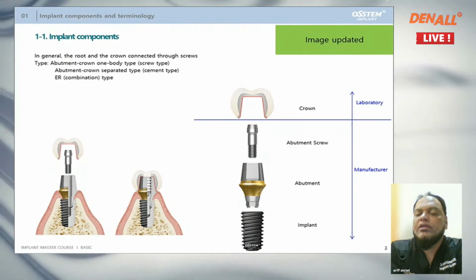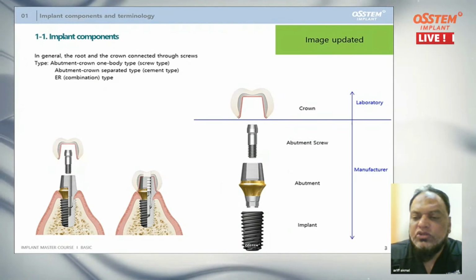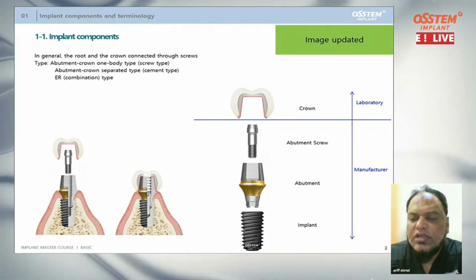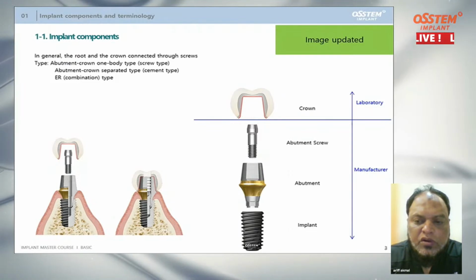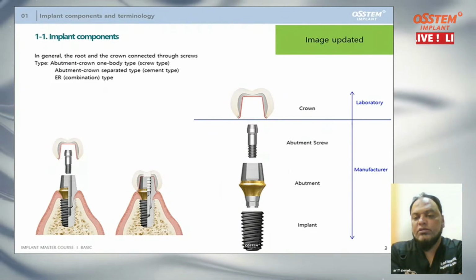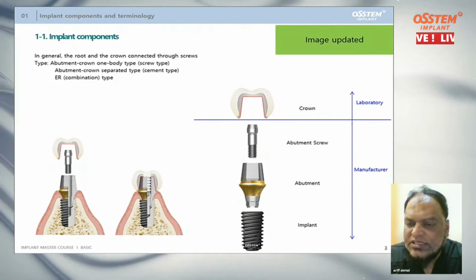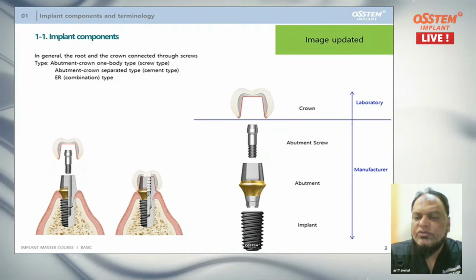So you should be able to manage. Luckily, the osteotomy was almost done. So I started placing the implant with an endomotor. That is how you should be able to manage. It has been almost 7 years since I did that, and the patient is doing excellent.